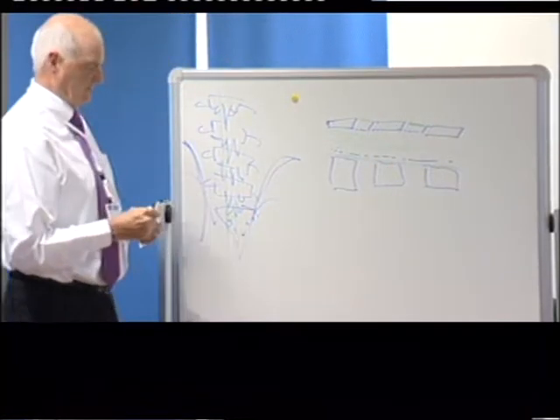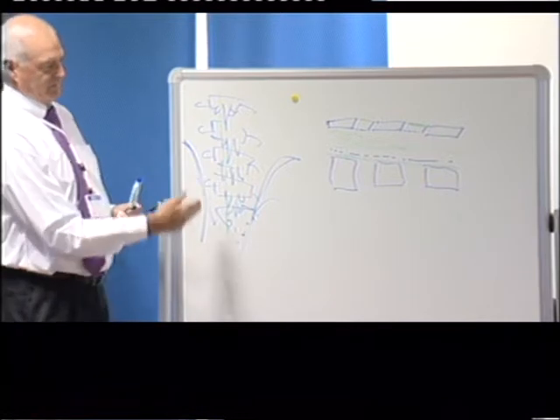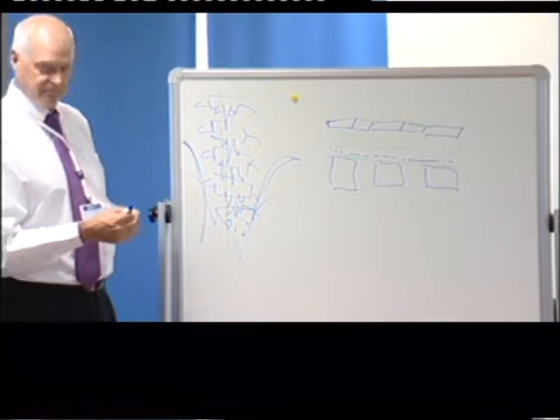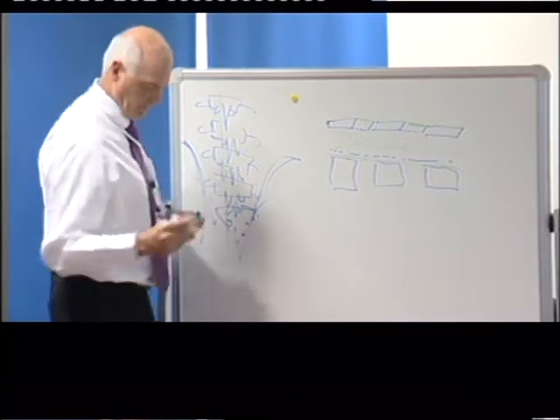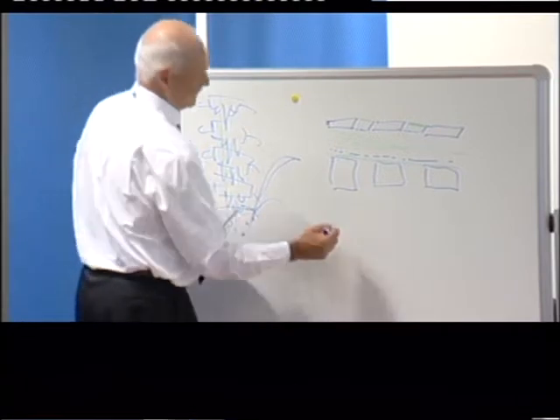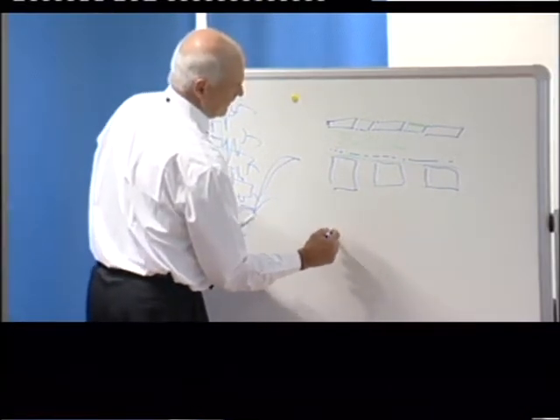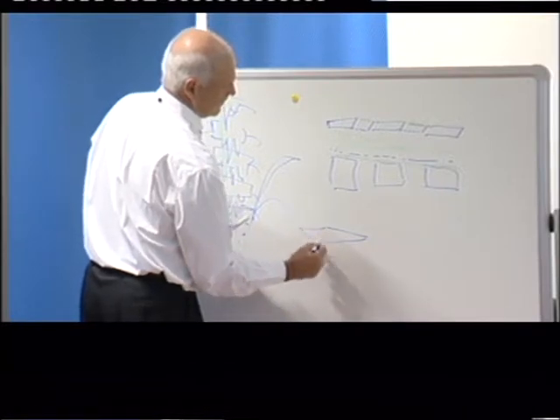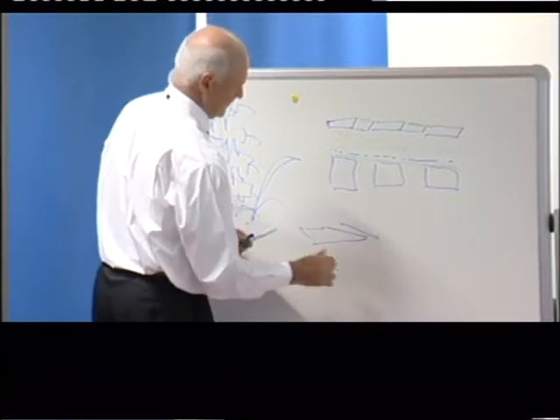Okay. So that's going to be the first slice, and then the second slice is going to be the facets. La seconda longitudinale saranno le faccette. Sarà più esterna la seconda visione. So we're going to, let's go the other way.